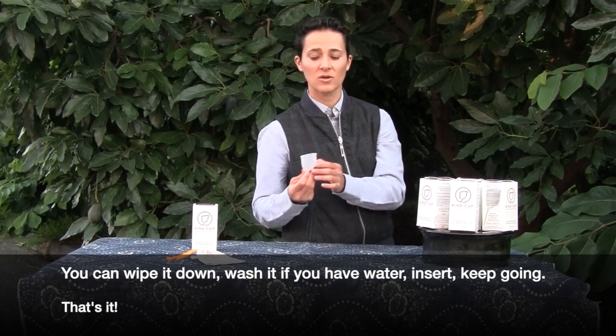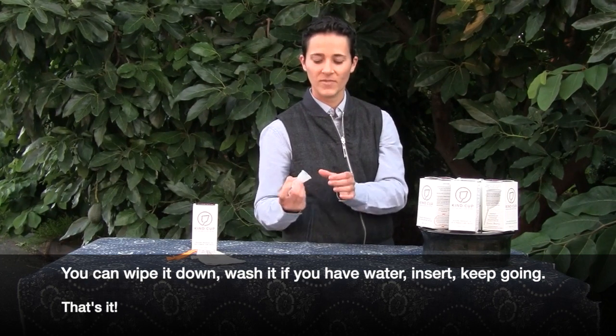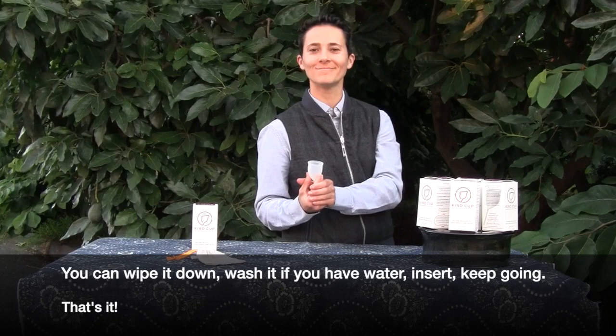You can wipe it down, wash it if you have water, insert, keep going. That's it.